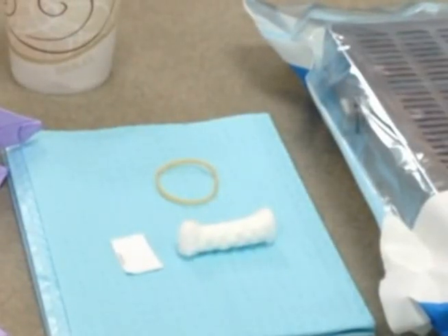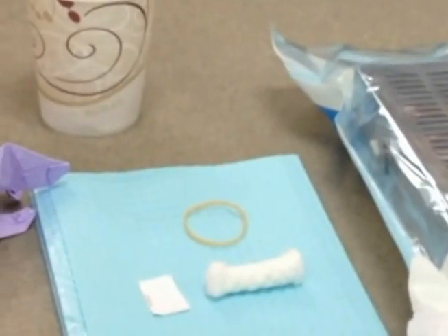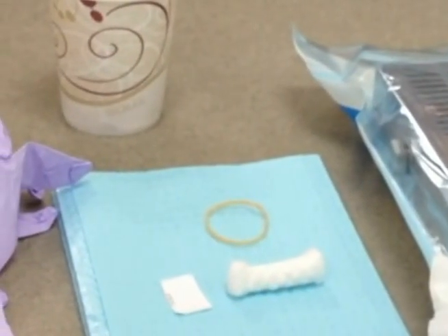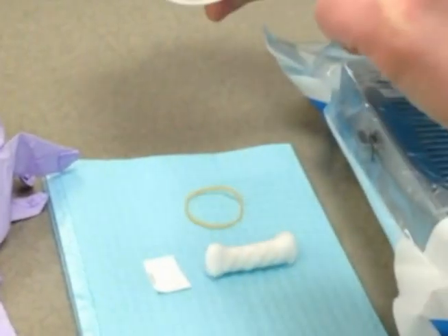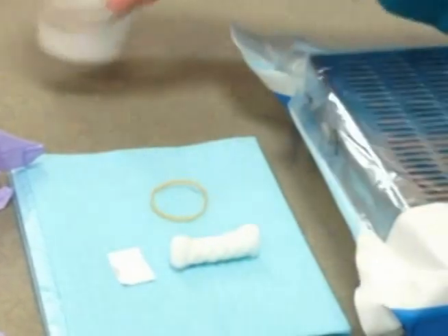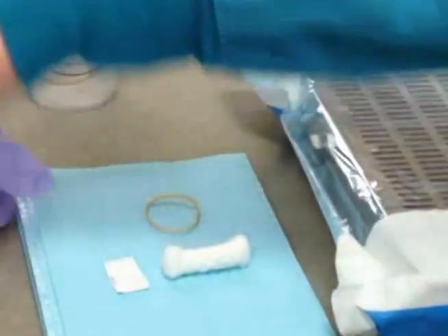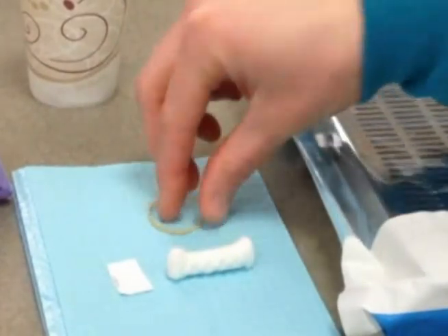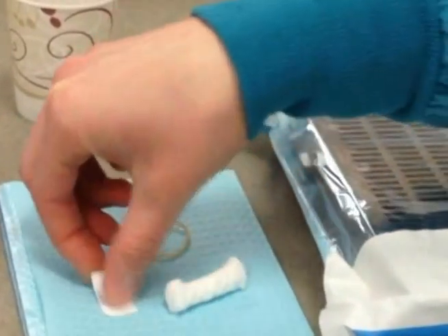The first step in taking a mandibular central incisor periapical is to get the radiology unit ready for your patient. You start by grabbing a Dixie cup that has size 1 film from Kathy or Karen, a cassette with the XCP instruments you will need, a few sets of gloves, rubber bands, cotton rolls, and a tab if you prefer using them.